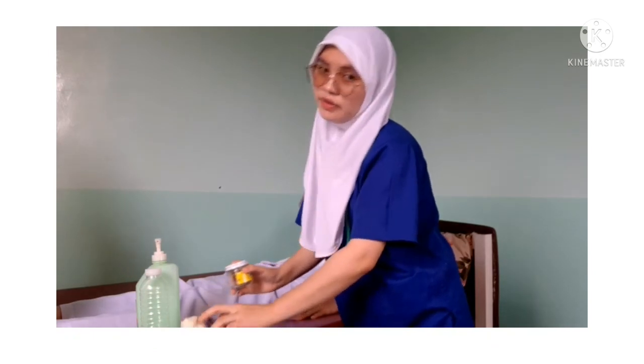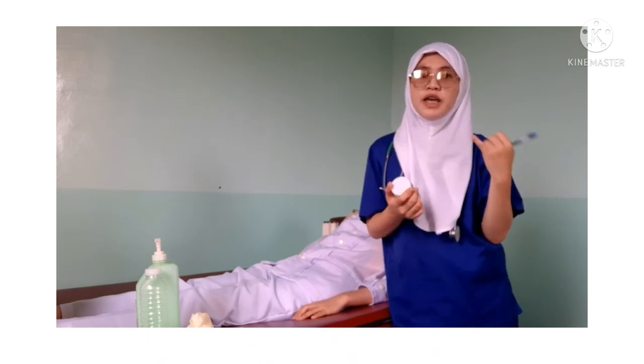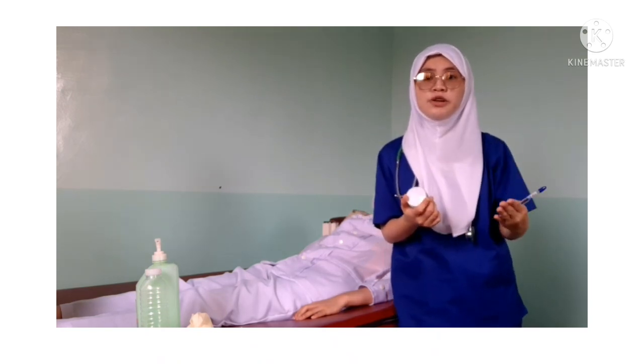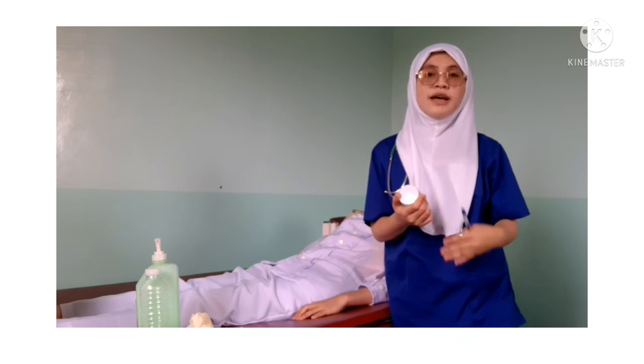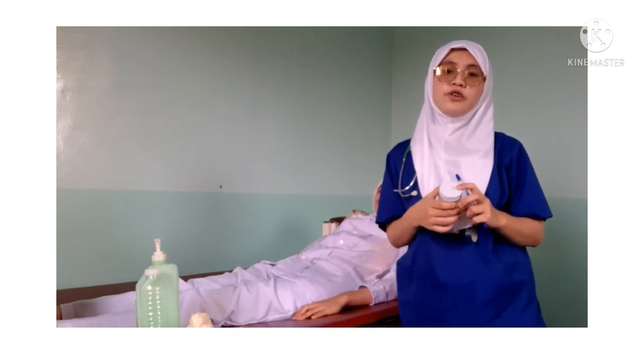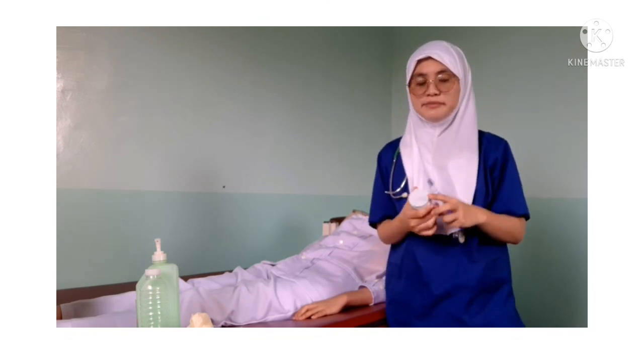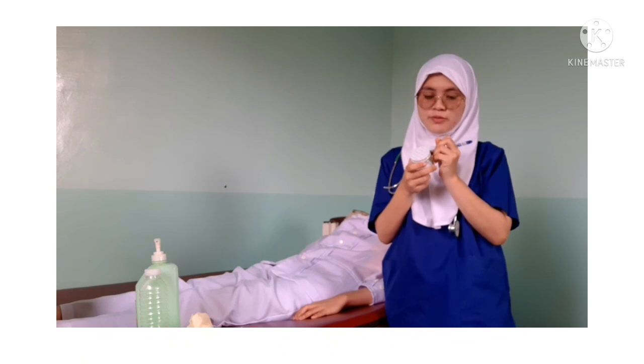Next is to label the specimen container with the patient's name, age, date, and the number of collected specimens. Send the container together with the request to the laboratory to avoid confusion and exchanging of specimens for baseline data. That will be all. Thank you.